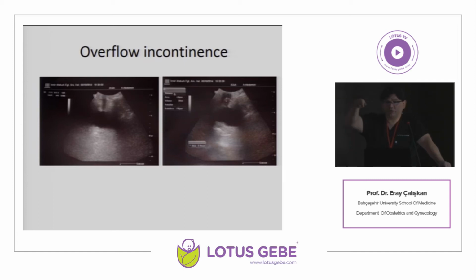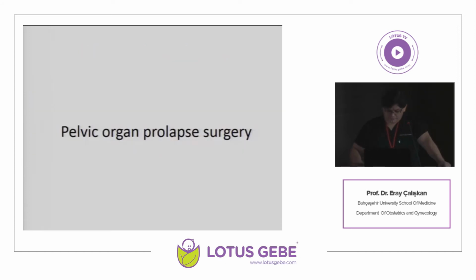And if you place your probe in the lower abdomen, or just with perineal or transvaginal ultrasound, you will see that the bladder is full. You can also verify it. And for follow-up, we also use it to evaluate the response of the patient to the medication. For catheterization, we also check for this.